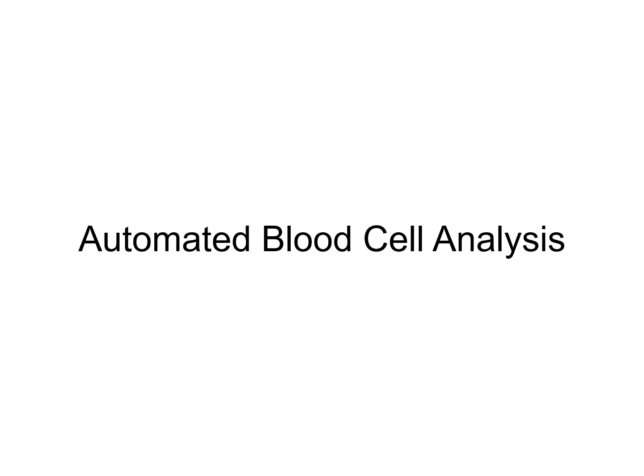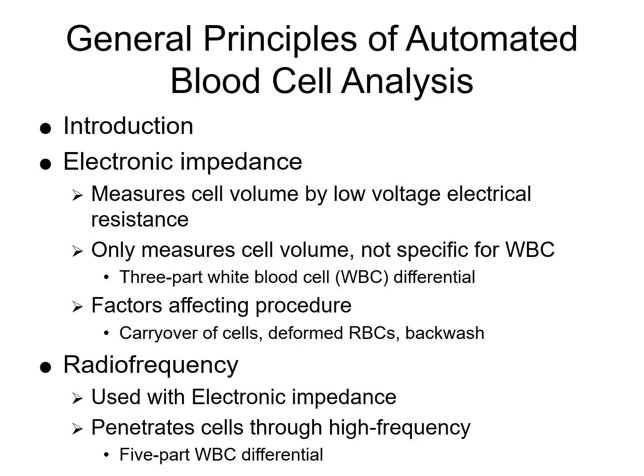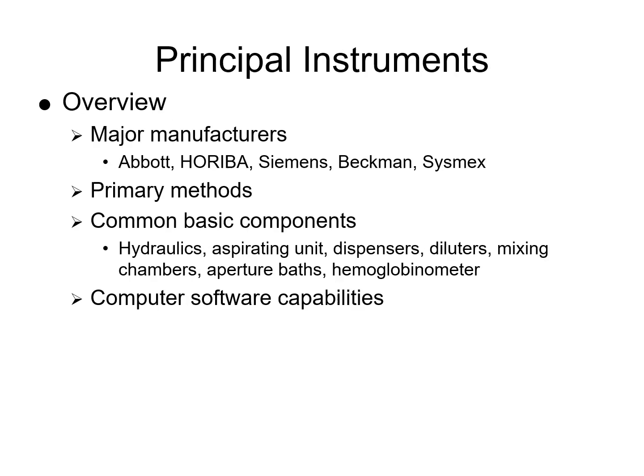Automated blood cell analysis. Automation basically replaced manual testing back in the 1980s. Automation allows more efficient workload management and timely diagnosis. An overview of hematology analyzers.